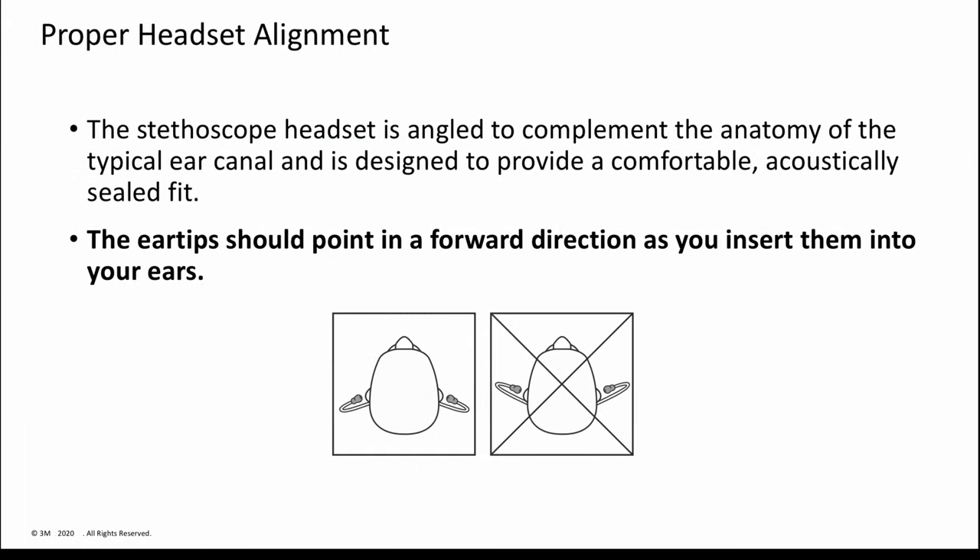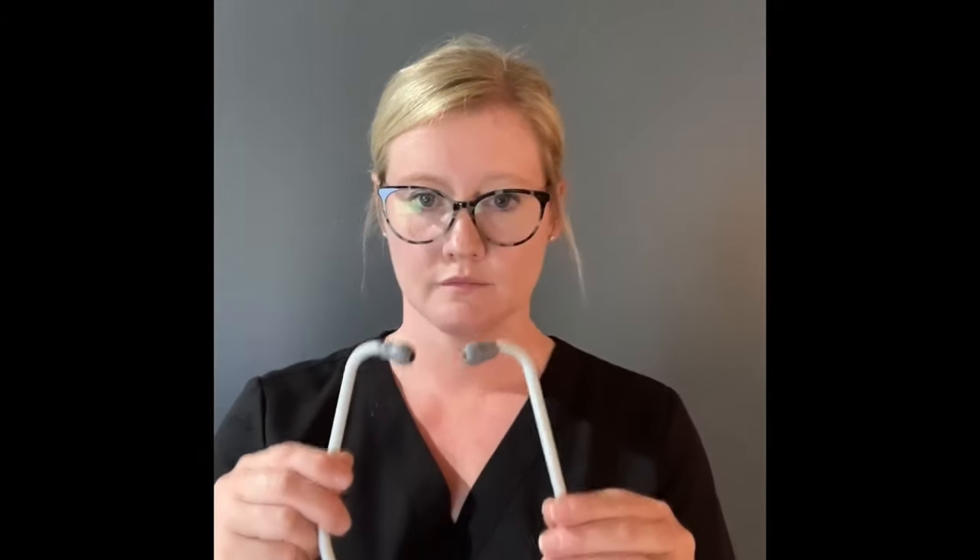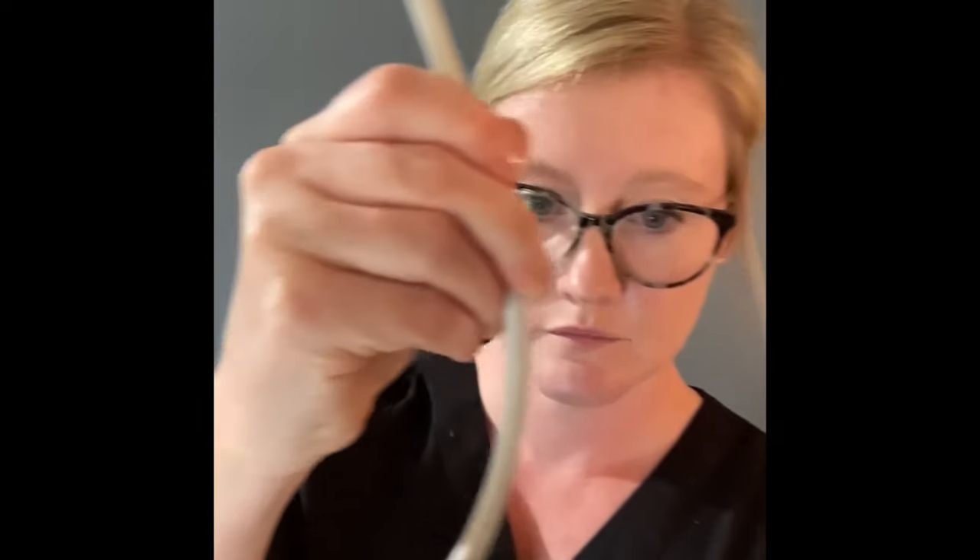The headset has been designed to anatomically match the correct angle of your ear canals. Before placing the ear tips in your ears, make sure they point forward. This ensures that the ear tubes will align with your ear canals for comfort and maximum sound transmission. Holding the headset in front of you with one ear tube in each hand, pull the headset open and place the ear tips into your ears. A simple reminder for proper headset alignment is to have the CE mark facing your chest.